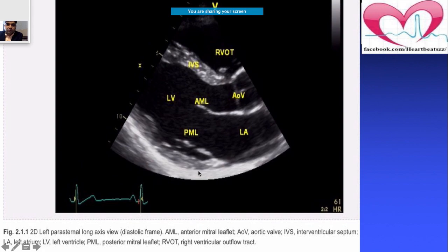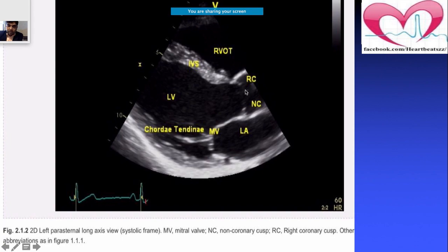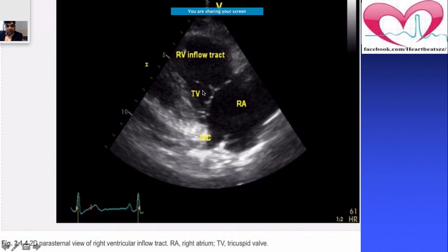In the left parasternal long axis view, if there is chordae tendineae rupture, you may see these chords in the systolic frame. The LA, LV, non-coronary cusp, right coronary cusp, and RVOT are all visible here. For the RV inflow tract view, you tilt the probe slightly from the parasternal long axis position to visualize the RV inflow tract.